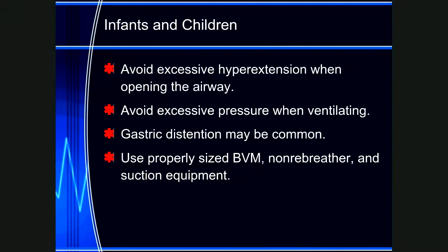We want to avoid excessive ventilation pressures and volume. We only want to give enough to make the chest rise. Excess air, if we bag too much, will enter the stomach and cause gastric distension. Think about blowing up a balloon. You blow up a balloon, blow up a balloon, blow up a balloon, it's eventually going to burst. Well, that's the same thing with gastric distension.